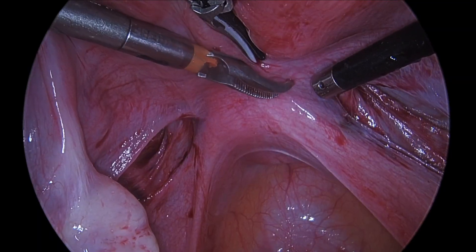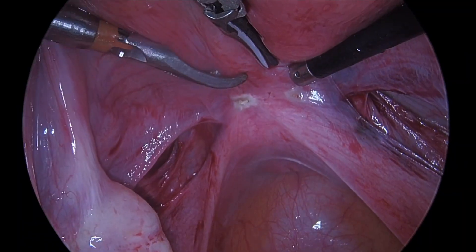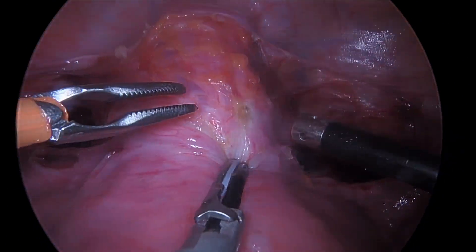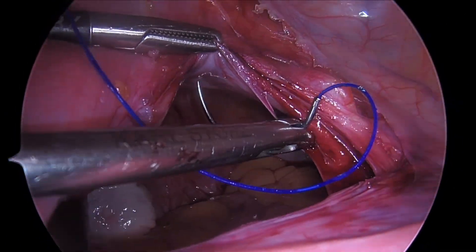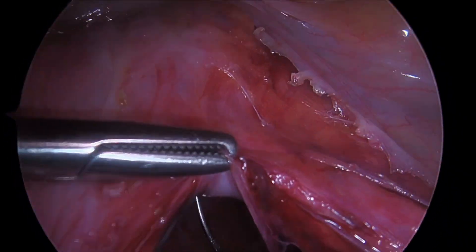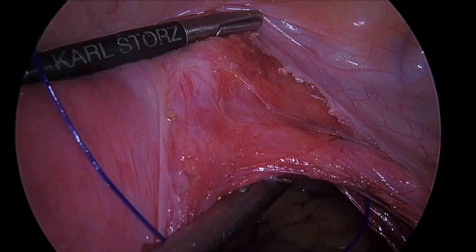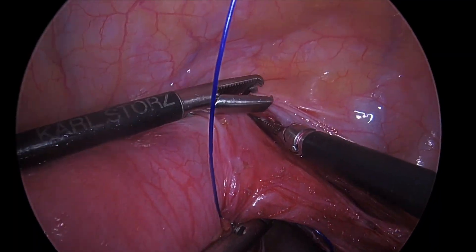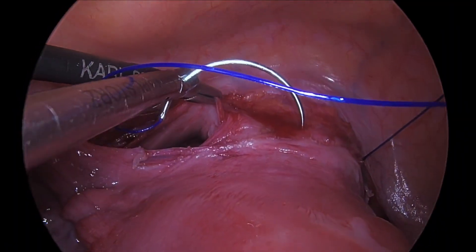The location of the internal os is identified posteriorly, just cephalad to the insertion of the uterosacral ligaments. This insertion point is marked with the bipolar bilaterally, and this is repeated anteriorly. An OCT1 polypropylene monofilament suture is placed into the abdomen through the 10 mm umbilical port. A 30-degree laparoscope allows for direct visualization of the posterior insertion and anterior exit sites that were previously marked, identifiable through the broad ligament windows.